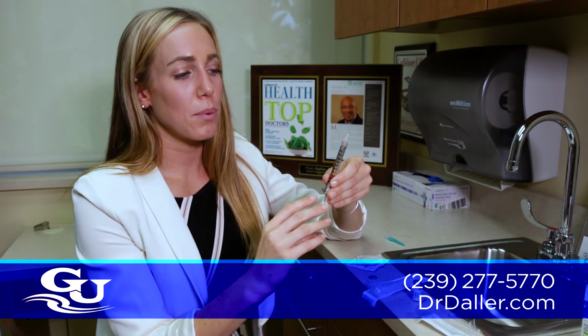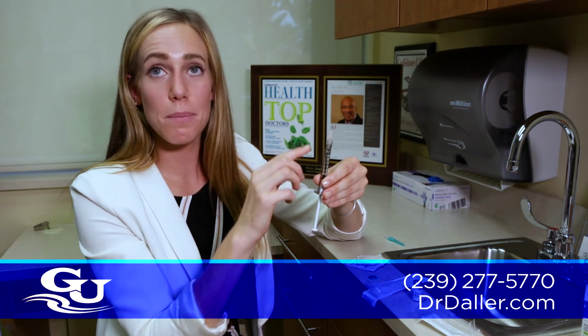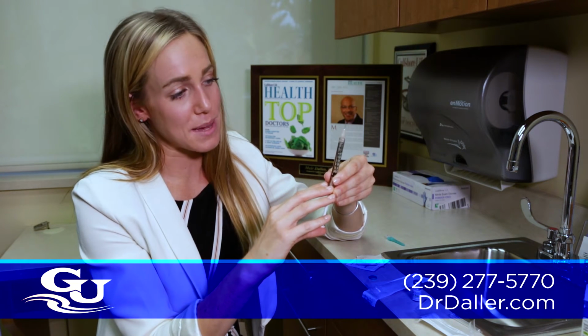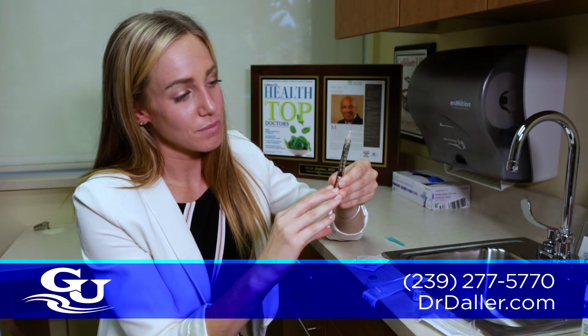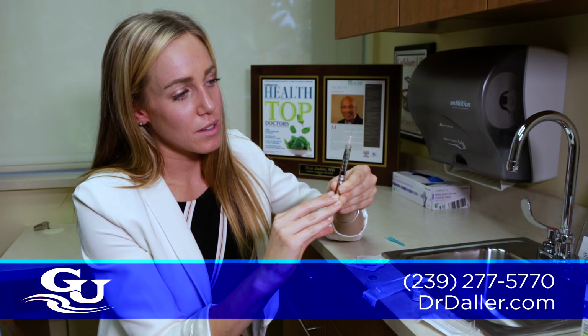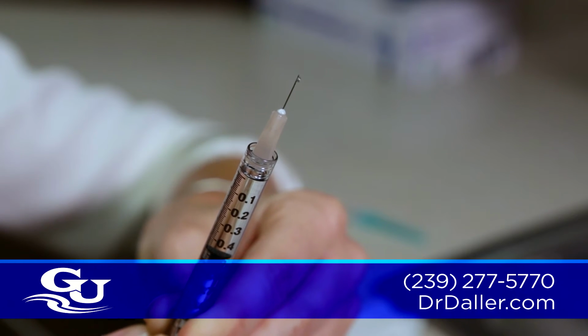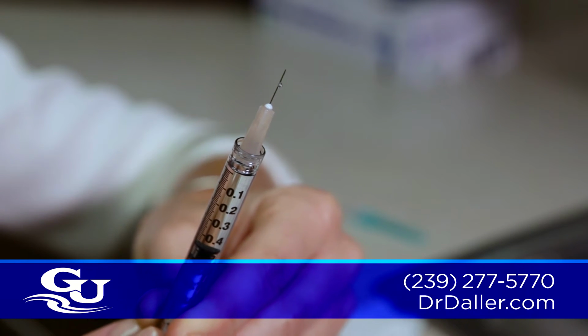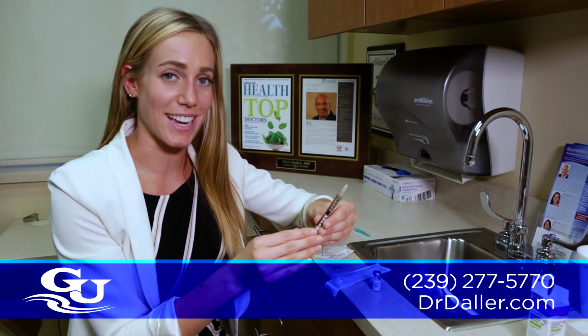Remove your cap, and then what you want to do is push all the air out of the syringe until you see a drop of the testosterone come out of the tip. What this will do is lubricate the needle to ensure that it's a painless procedure. So we keep pushing the air out, and I see a drop coming from the needle right like that. Now set your needle down so that you can prepare your injection site.